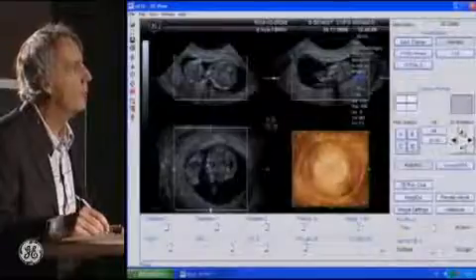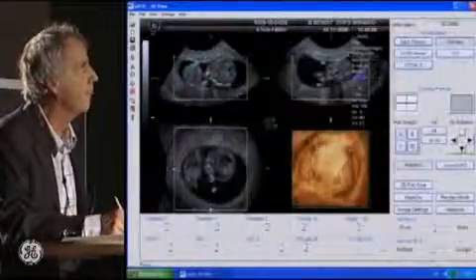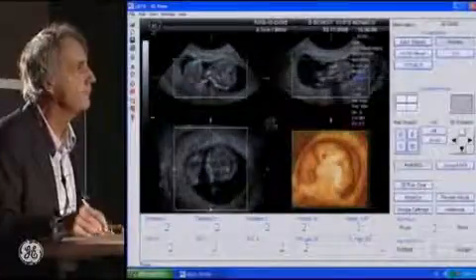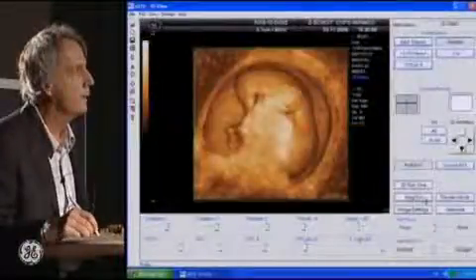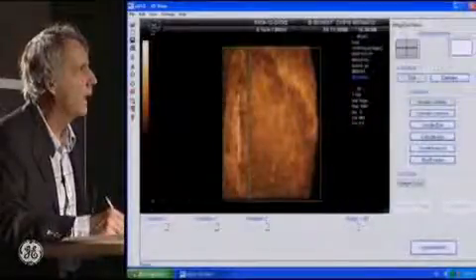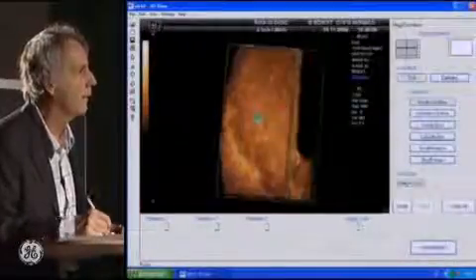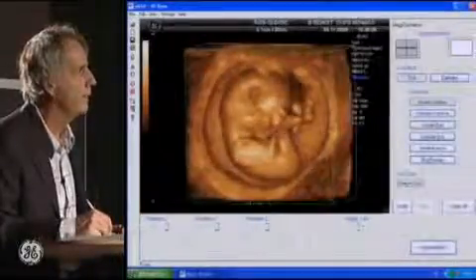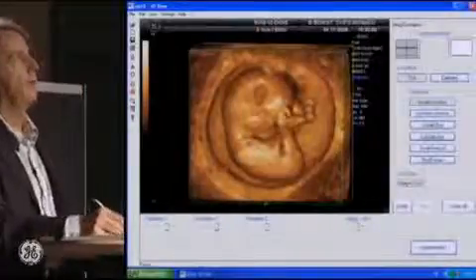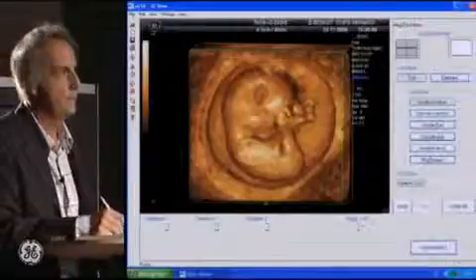This is early pregnancy, 11 weeks, but something is wrong. I will use magic cut. I cut this part. And this is a fetus, and you can see the head is huge compared to the body. It was a triploidy. So thank you for your attention.